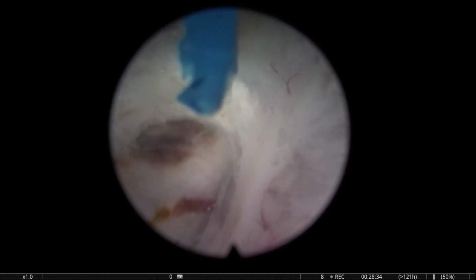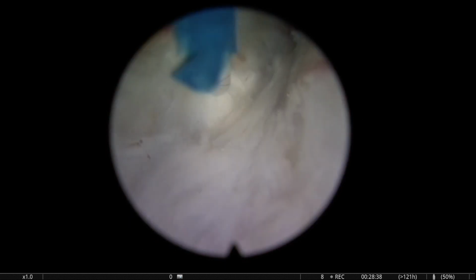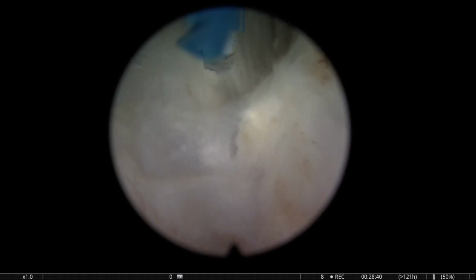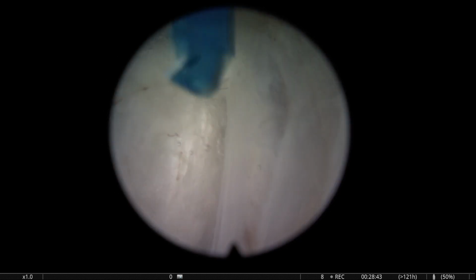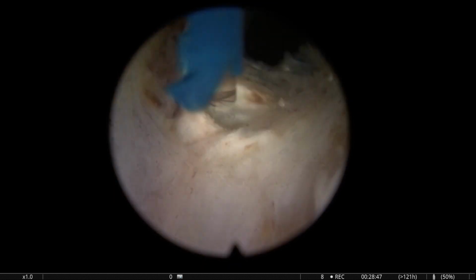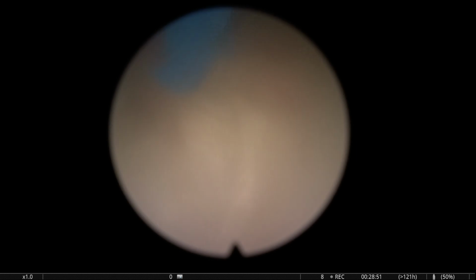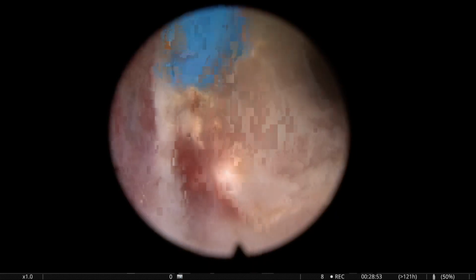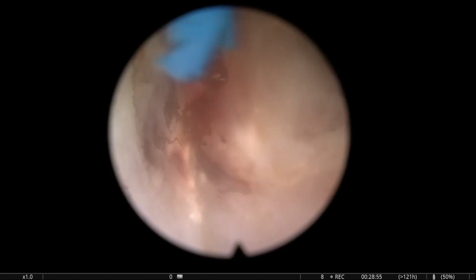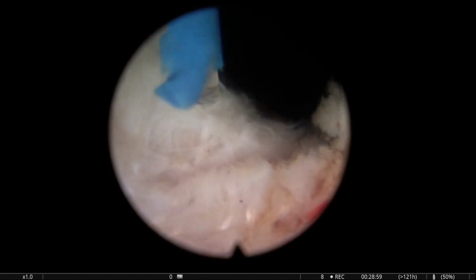If you do an en-bloc technique and the early apical liberation, you follow certain steps. But of course, we have to be conscious of the surgical principles of how to use a laser, how to modulate the effect of the laser, how to make the most of the settings that you have chosen.